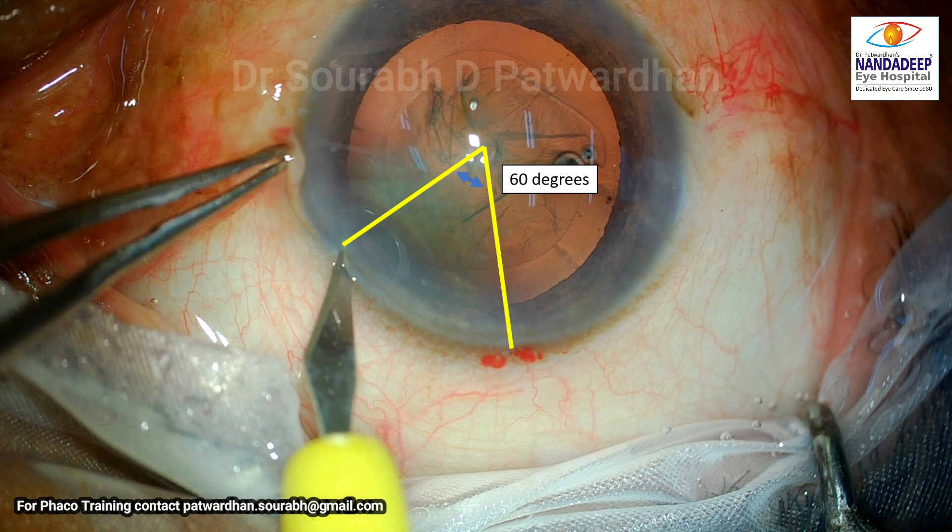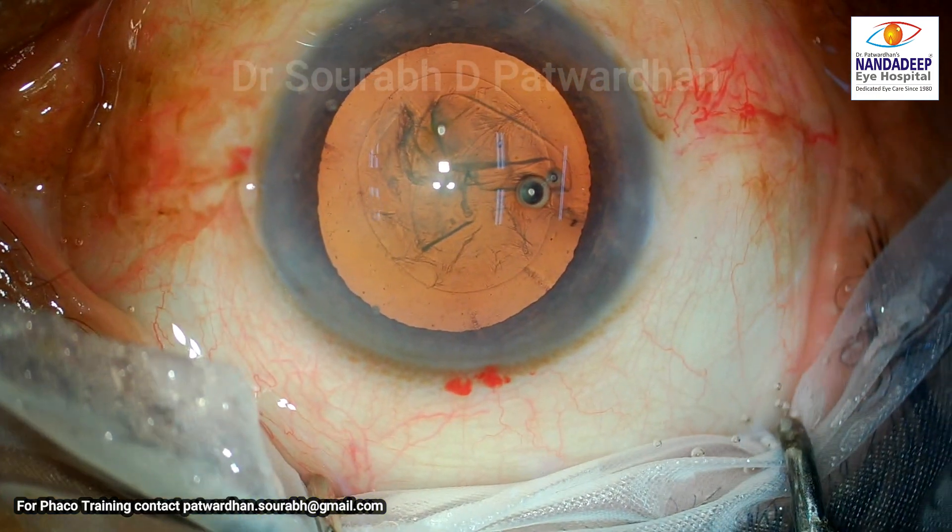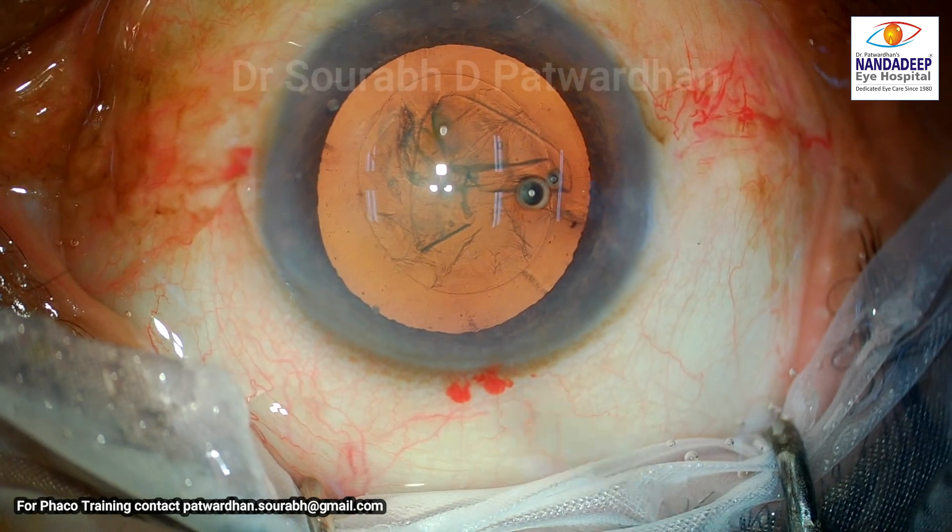Also, if you see, the angle between the main incision and the side incision is just 60 degrees, which is not going to give good control over the globe when the surgeon is operating. I would recommend an angle of at least 90 degrees or more between the main incision and the left side port incision, so that when the globe moves away from the surgeon, the surgeon still has good control via the left side port incision.